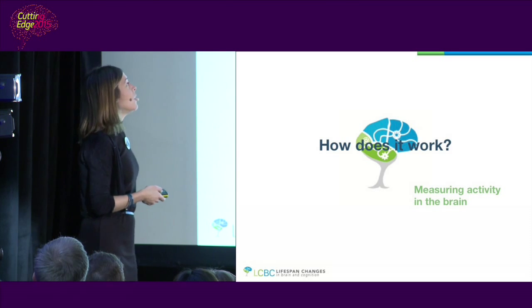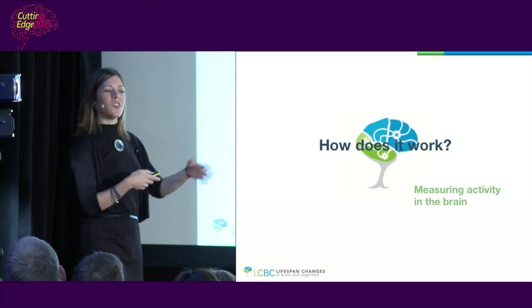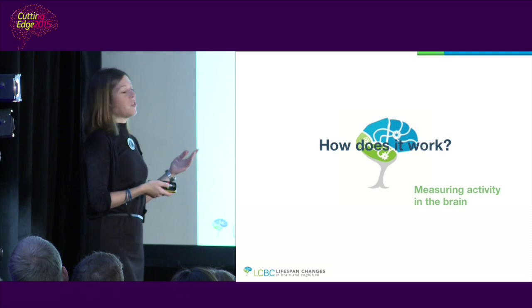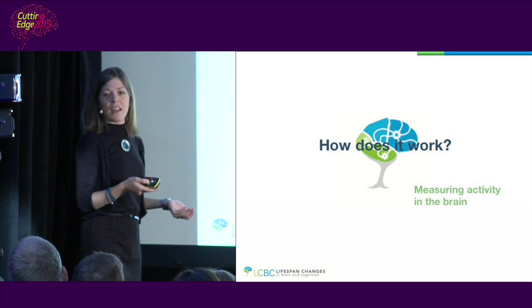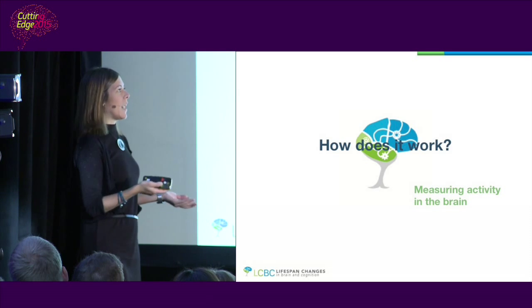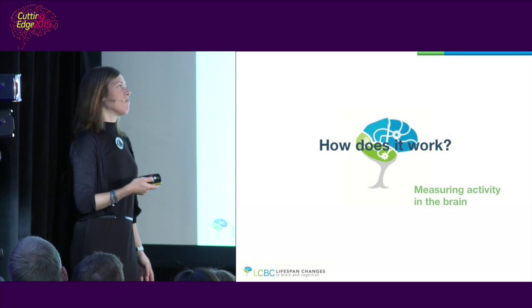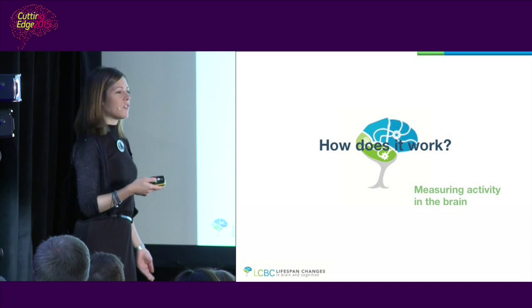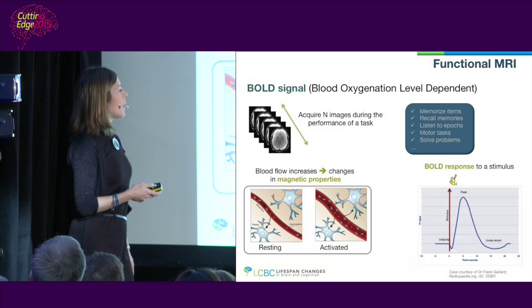In this modality, we put the subject also inside the machine, and we acquire during a certain period of time. And we ask the subject to do something. This something can be something very easy, like finger tapping or some motor task. But it can also be something very complicated, like solving mathematical problems or any kind of cognitive task or memory task.